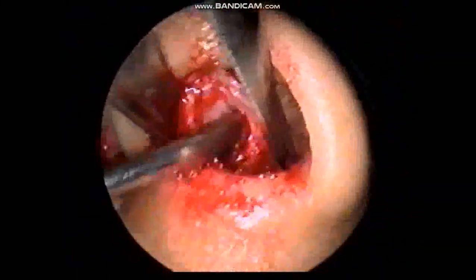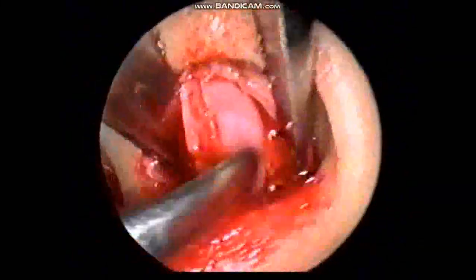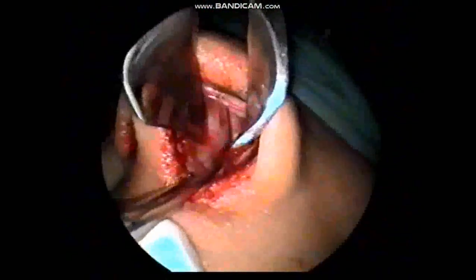There you can see the septal cartilage. Now you can see the white cartilage, and the mucoperichondrium is elevated on one side from below upwards, from the floor to the roof of the nasal septum. You can see the flap being elevated. Once you are in a proper plane, the elevation of the mucoperichondrium is very easy. The elevator just sweeps in and you can go from anterior to posterior without any difficulty. So the plane is very important.